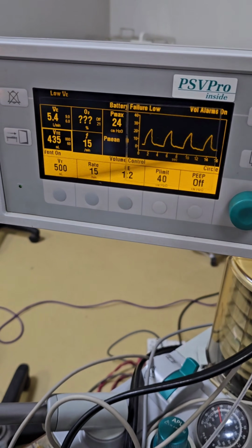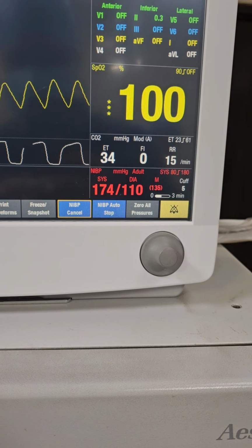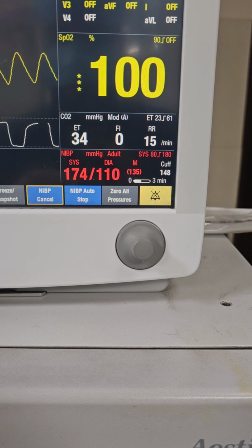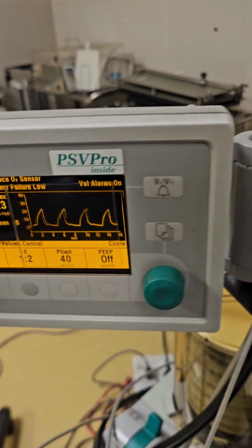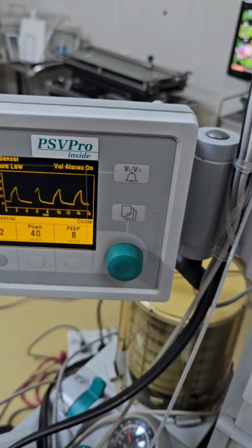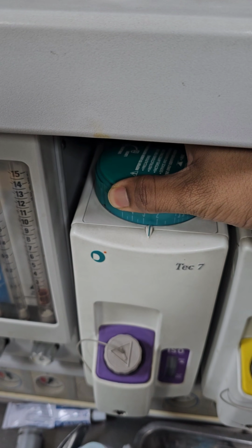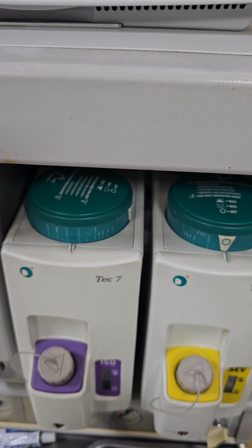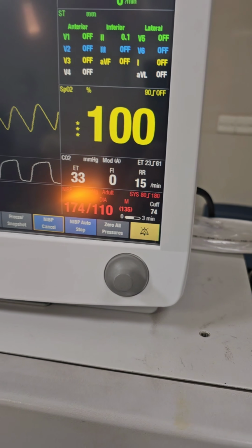Now we are seeing the ventilator setup and the hemodynamics on the monitor. The blood pressure has increased somewhat higher, 174 by 110. So we have to manipulate the situation by the ventilator setup. We are going to increase the PEEP to reduce the blood pressure, and we increase the isoflurane to some extent to reduce the blood pressure. Actually, we are increasing it to quickly fill the lung with isoflurane.